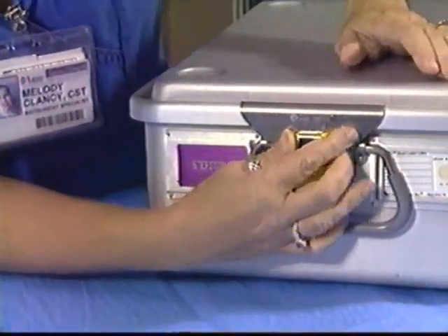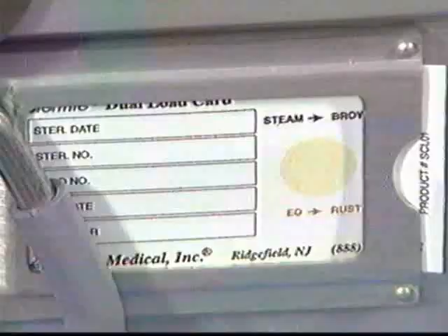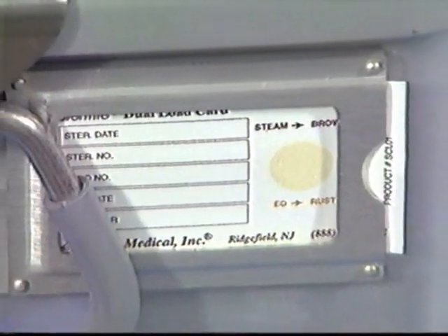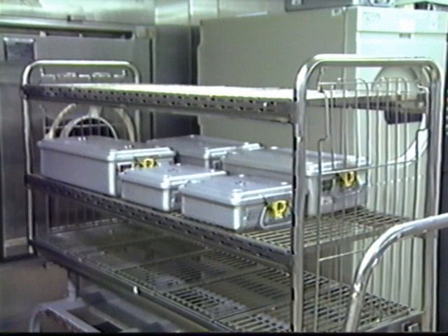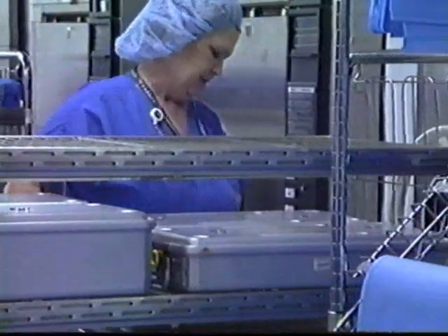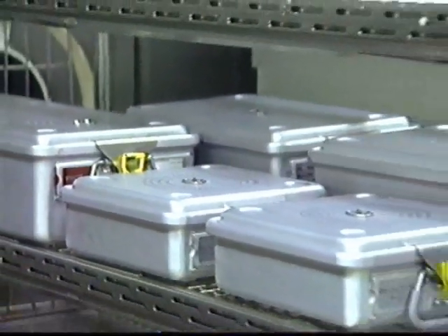Thread the guide on the Stereotype tamper evidence seal through the lock holder and secure. Repeat on both latches. An external indicator should be attached to the container at this time. Place the Stereotype container flat on the shelf of the sterilizer cart. If needed, up to three containers may be stacked and processed in an autoclave.